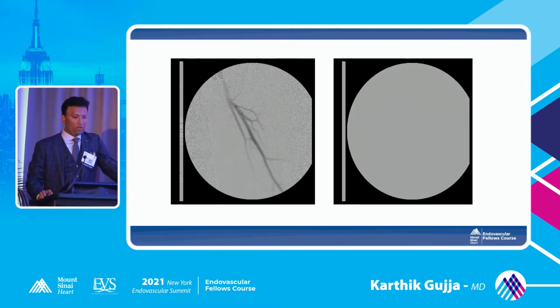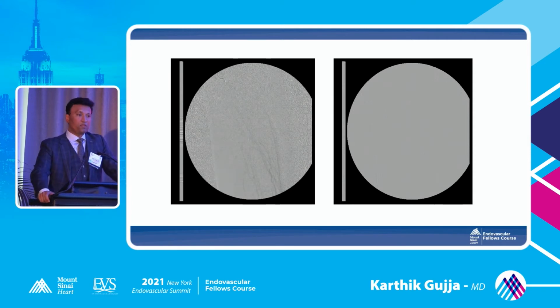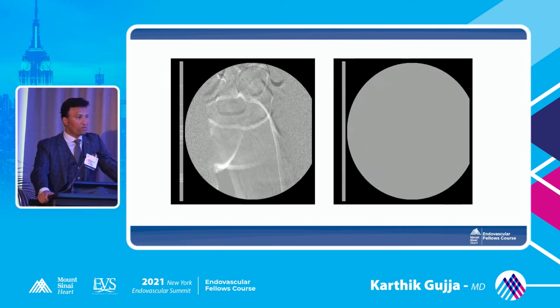Okay. So we get access on the right side. In Sinai, this is a bread and butter CTO, so I'll go very quickly on it. We always get antegrade access. We always go from the other side. Most of the CTO lesions, at least most of the peripheral interventions, we try to do it from the femoral access. We reserve pedal access only if it's necessary. That's our style at Sinai, and most of us who work here, we do it the same way.